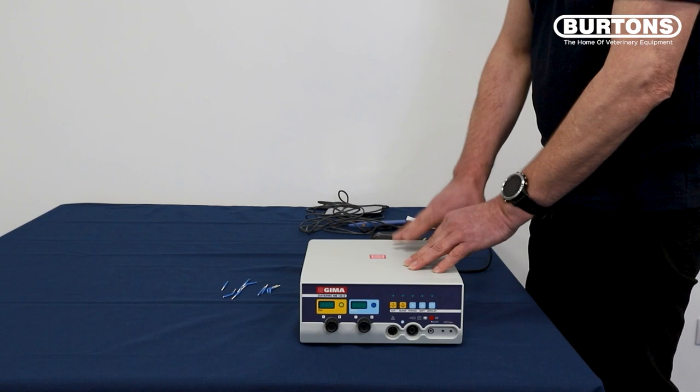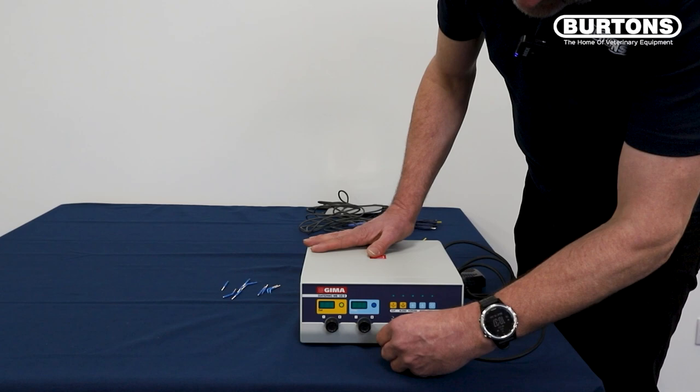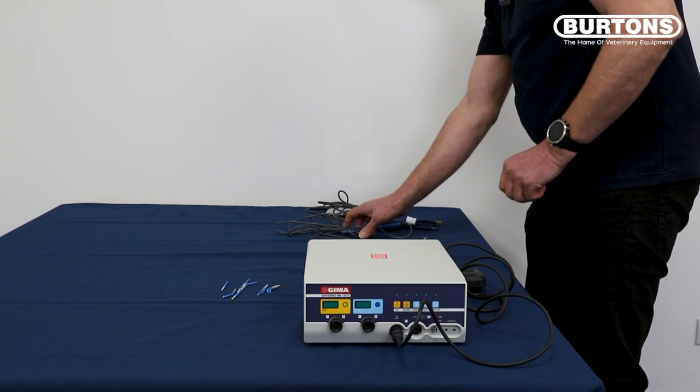So now we're going to set the machine up for use in monopolar mode. To do that, connect the foot pedal to the port where the icon shows a diagram of a foot pedal. Connect that there.